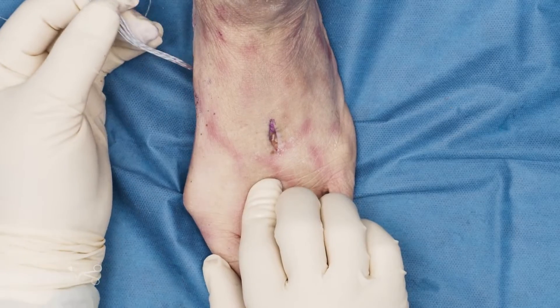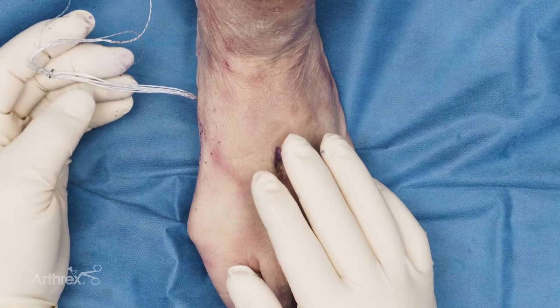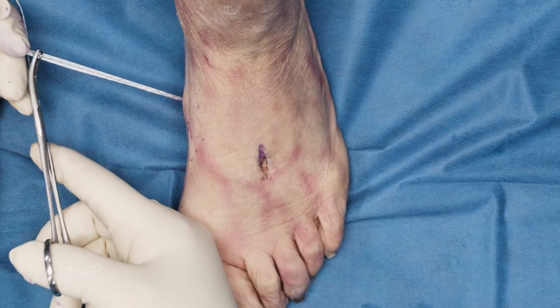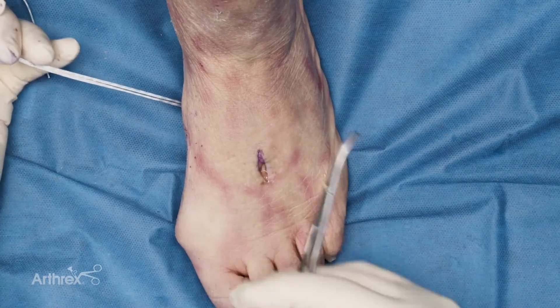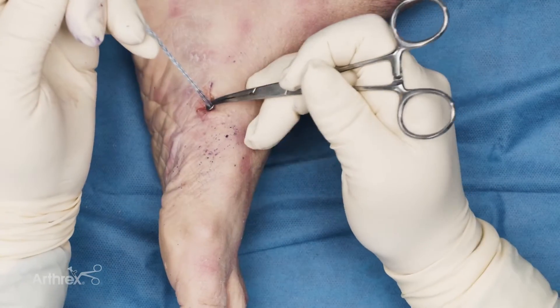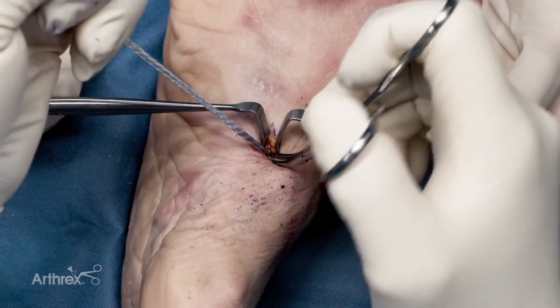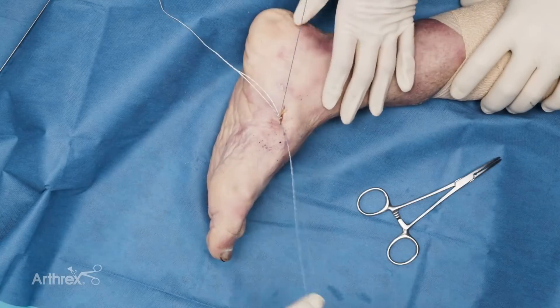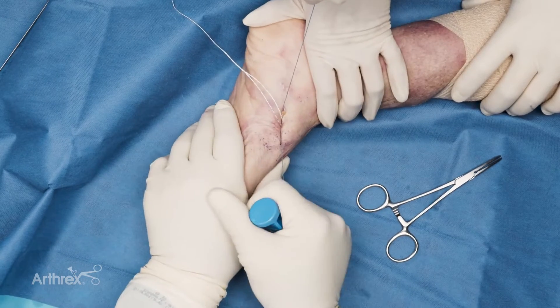This technique should allow this to completely suck down on its own, just like in a syndesmotic repair. Once I have it here, I'm going to take my button and slide it down until I'm convinced that I'm on the bone. I want to make sure the button is going to go down and is on the bone — I'm pushing down against the bone and my button's against it, so I'm comfortable I'm down in there. Now I can put my hand grips on and we can pull.